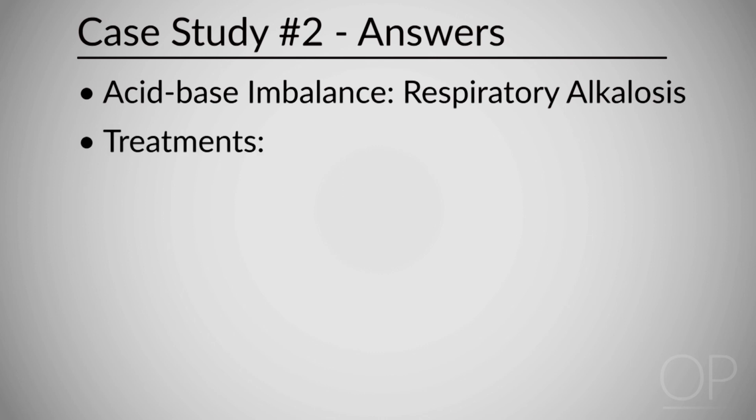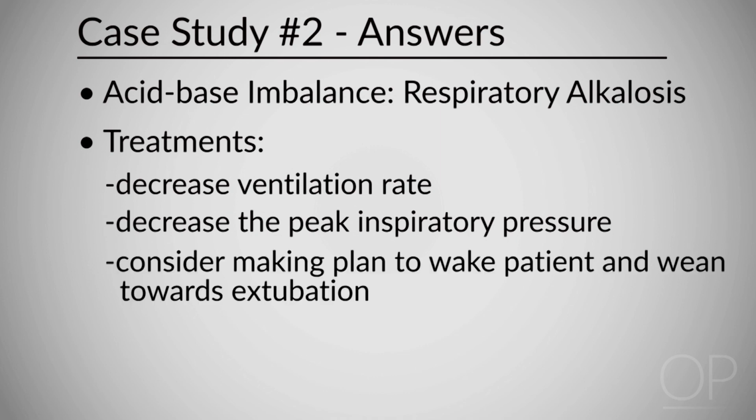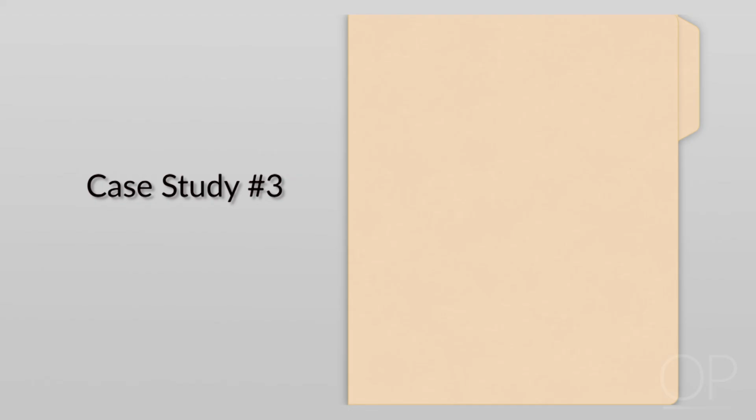These are the possible treatments. 1, decrease the ventilator rate to help retain carbon dioxide. Or 2, decrease the peak inspiratory pressure, which will reduce the tidal volume to help retain carbon dioxide. Or 3, consider making a plan to wake the patient up and wean towards extubation. Now it's time for case study number 3.